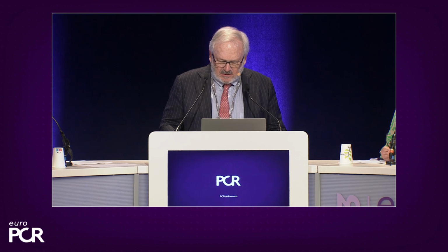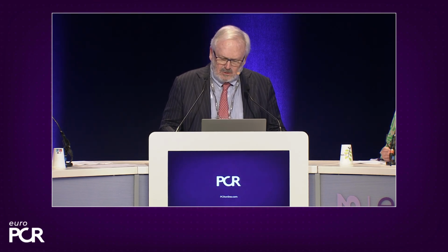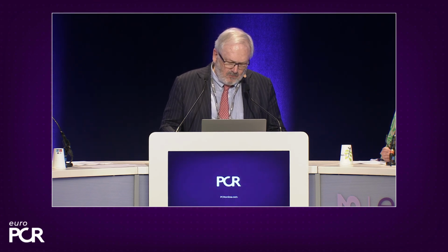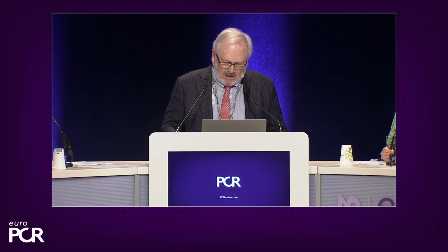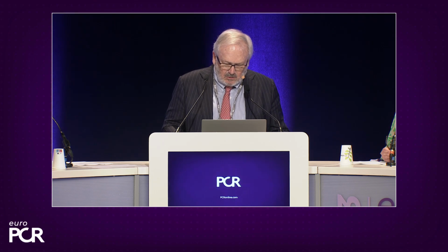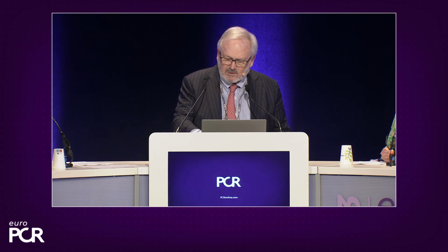And the topic is left main bifurcation treatment with ultra-thin Supraflex Cruz stent. And we will go from non-invasive imaging angiography to invasive assessment of anatomy and physiology. And I would like to introduce the people in the panel, in the studio, and eventually in the audience. I am Patrick Serruys from Galway, Ireland, and I will have the first slide.